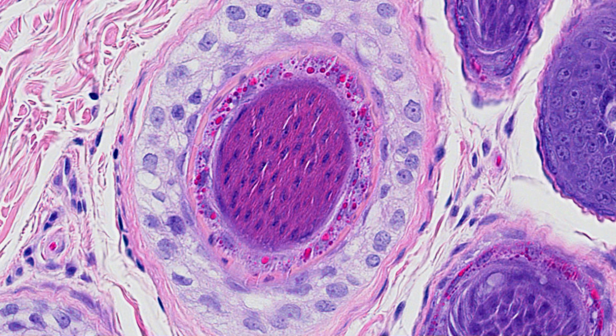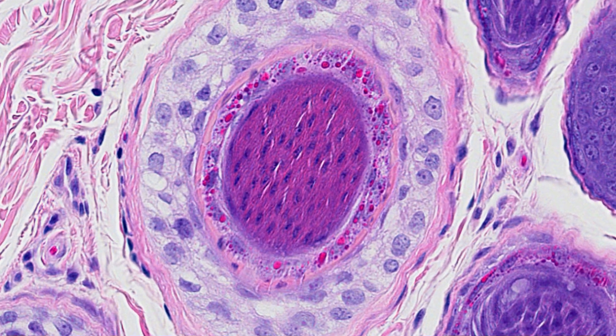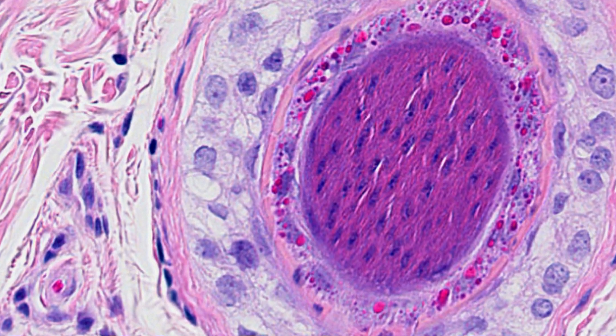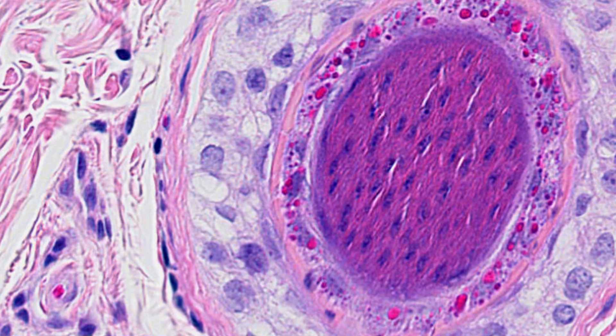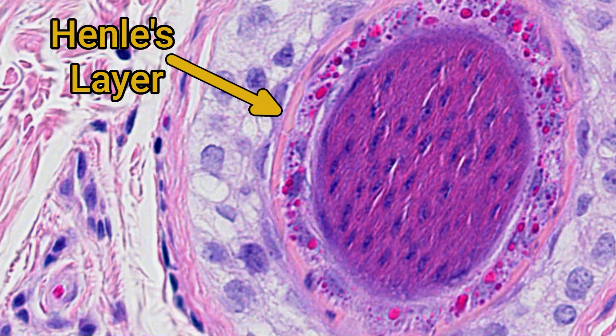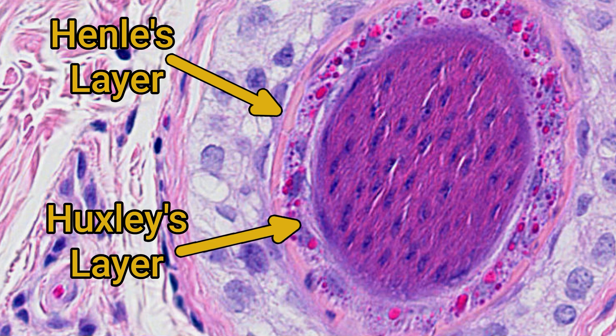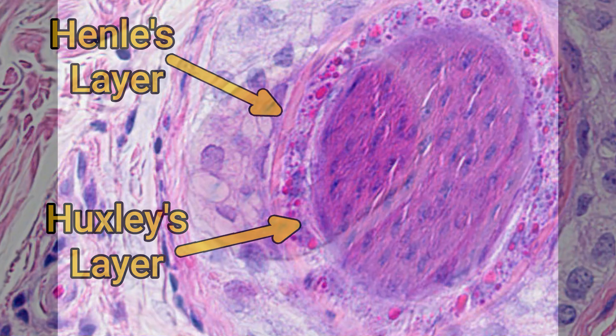Henley's layer is the first to cornify — losing the nucleus and much of the cytoplasm. The eosinophilic layer that has appeared is formed of cornifying cells; you can sometimes make out faint nuclei, so this must be Henley's layer. The other cells containing trichohyalin granules are Huxley's layer. The outer root sheath is beginning to thicken as well.